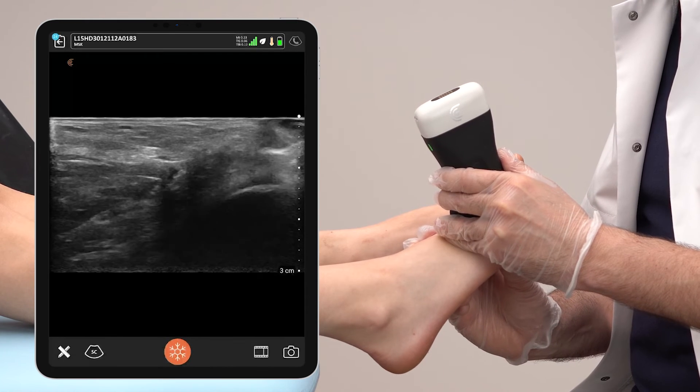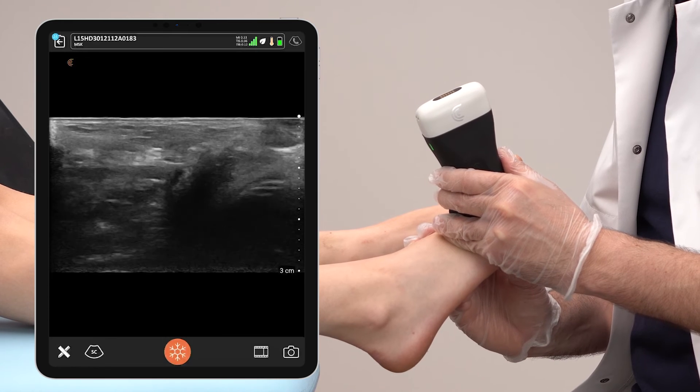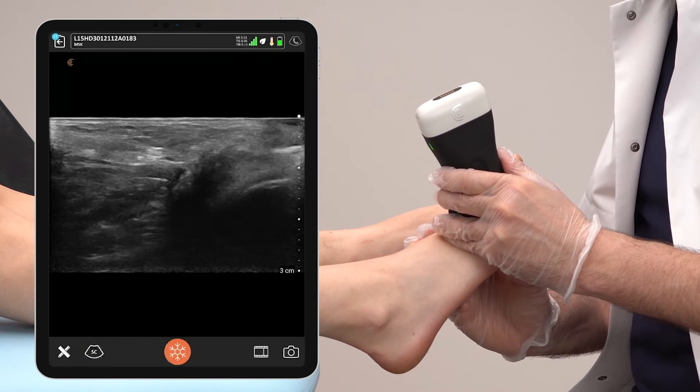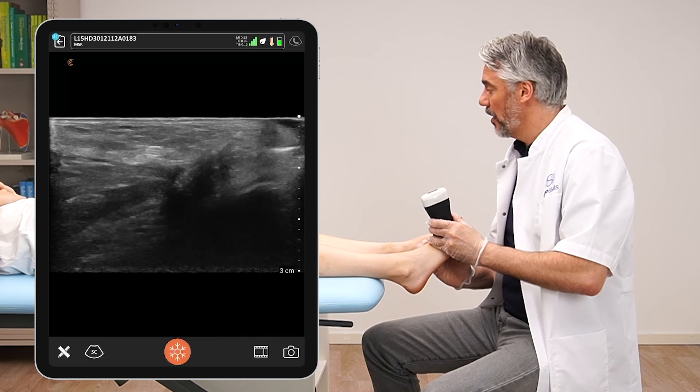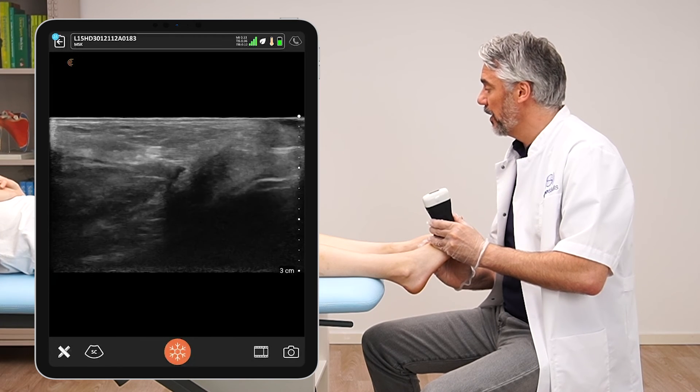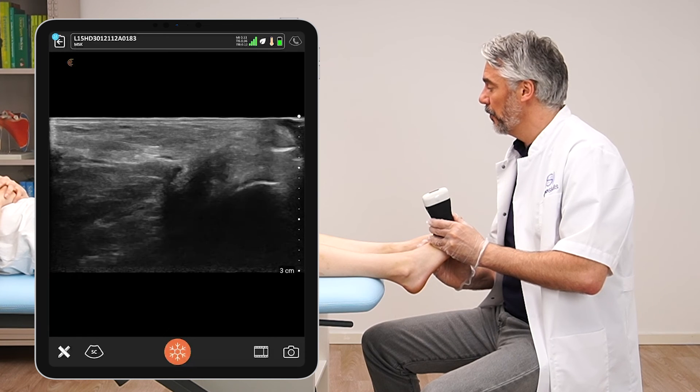This swirling makes the Morton's neuroma — and maybe also the bursa that surrounds the nerve — more visible. With this technique you will see the Morton's neuroma, because if you don't do it with the thumb, you definitely won't see it. So please use the thumb.